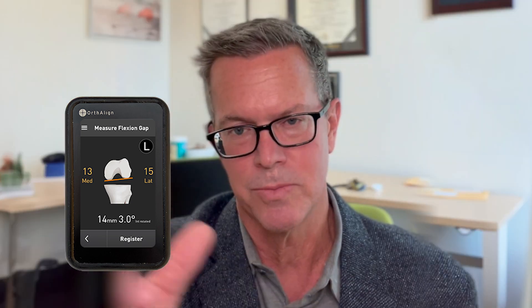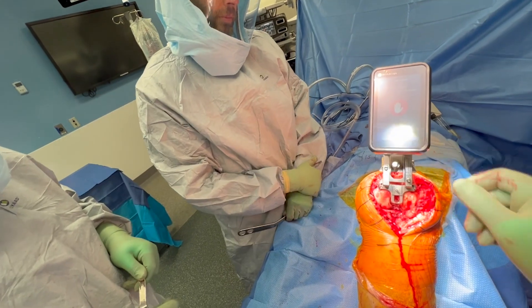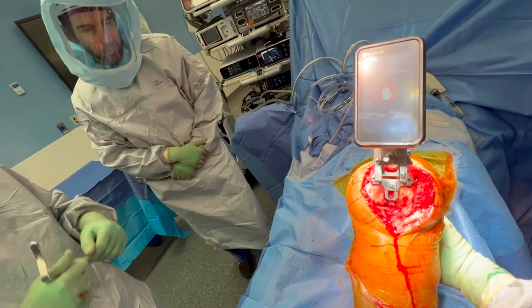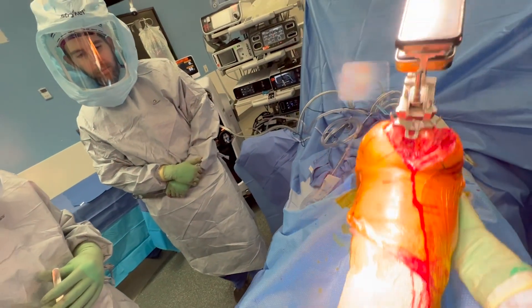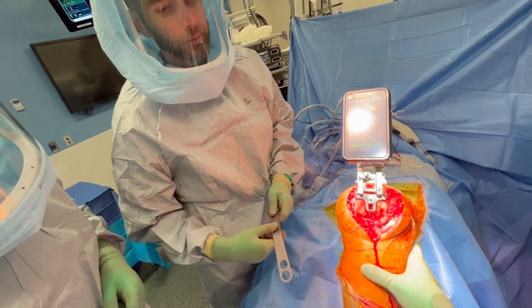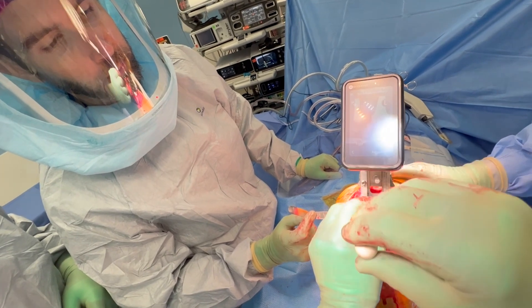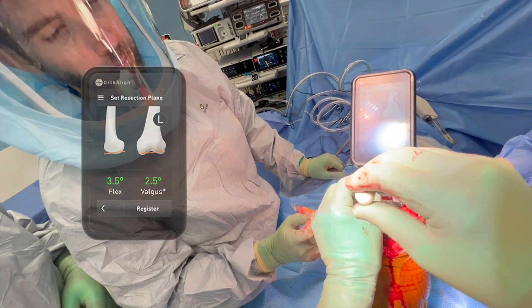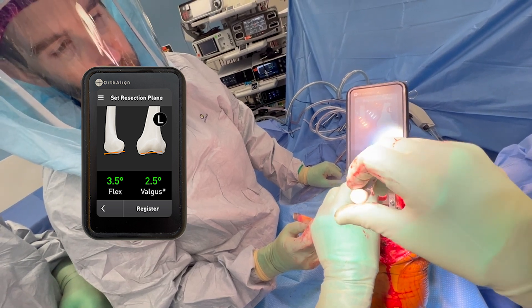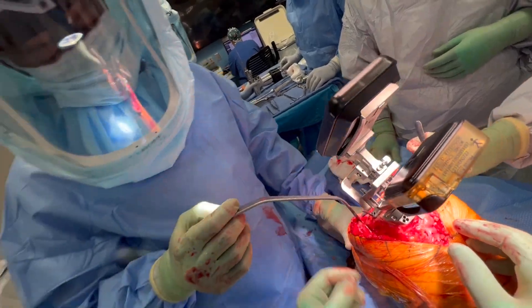The goal from this point forward is we're making rectangles — I'm trying to equalize all those numbers. Now we navigate the center of the femoral head with a simple medial-lateral flexion-extension that allows the computer to calculate the center of the femoral head. I'm going to start by placing the distal femoral cutting block to the reciprocal of the tibial cut — in this case, that's two-and-a-half degrees of valgus, to match the two-and-a-half degrees of varus I cut on the tibia.